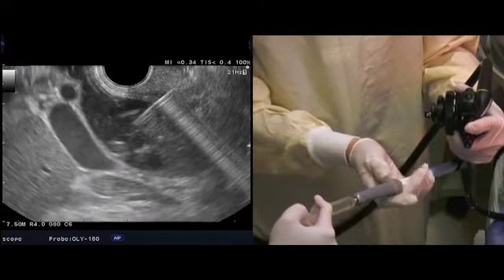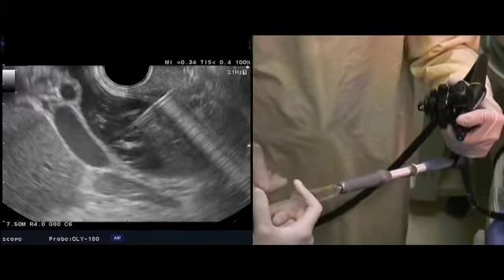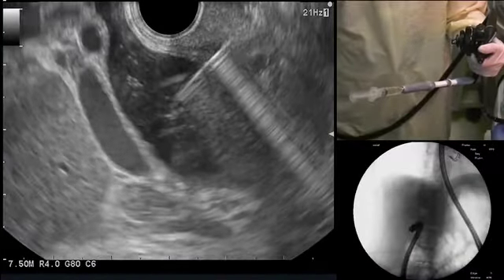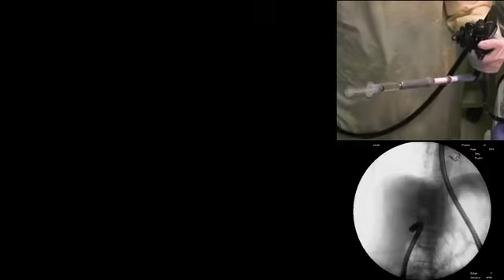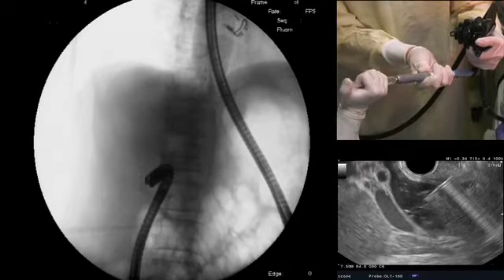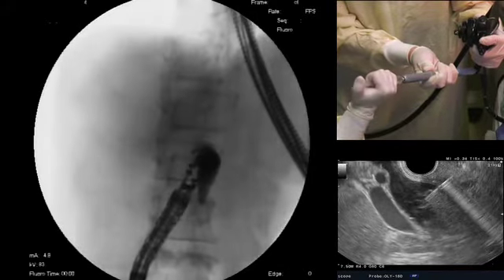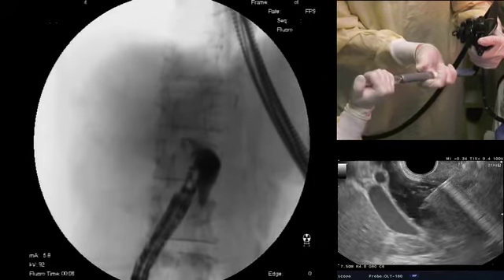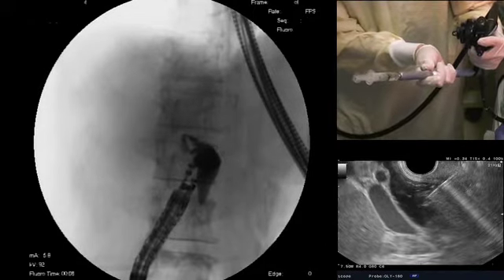So there's more contrast. At this point, if we can get a triple view, we can see what the fluoroscopy looks like. We're getting the fluoro into place. Let's keep injecting contrast — you can see the bile duct filling there. I'm sure that this is the common bile duct. You can see the cystic duct coming off at the top just as we saw on the EUS.